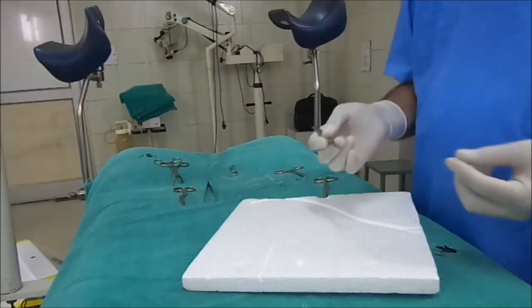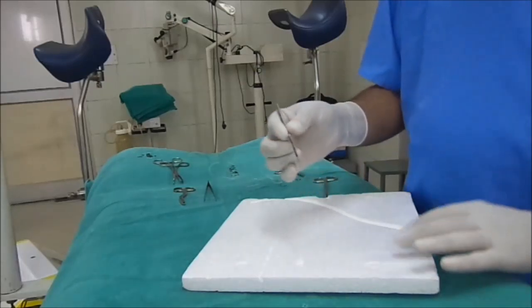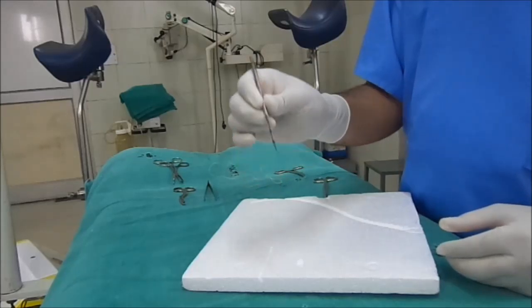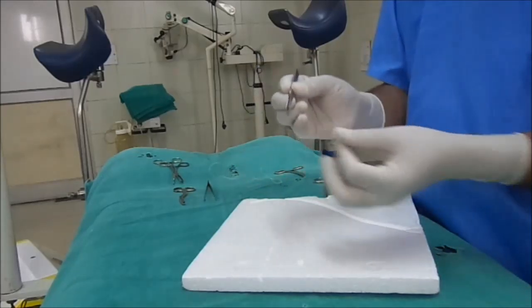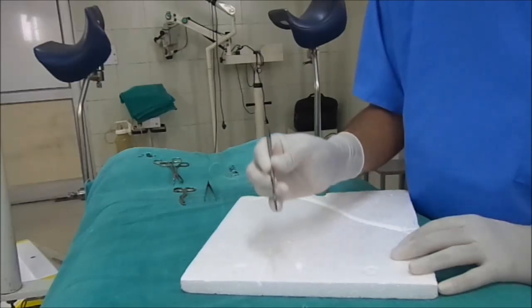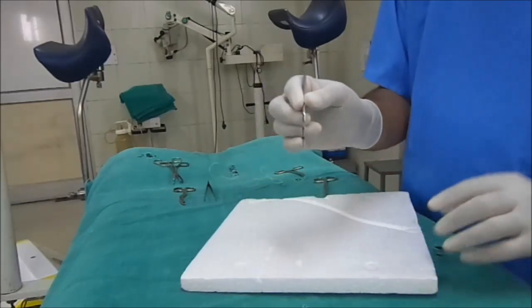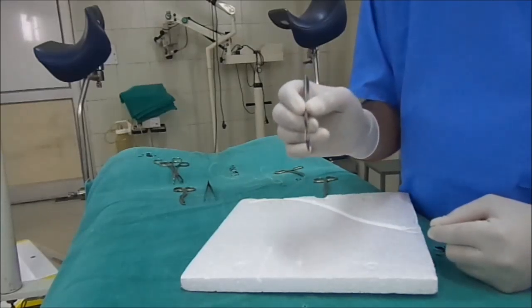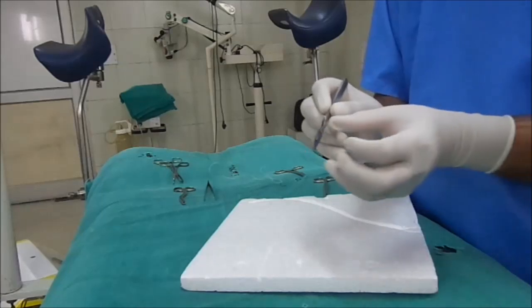While draining an abscess, when you perform the incision and drainage, we hold the scalpel in this manner and use the tip of the surgical blade in this way. While performing incision and drainage, it is better to use the number 11 blade, which is the pointed blade.